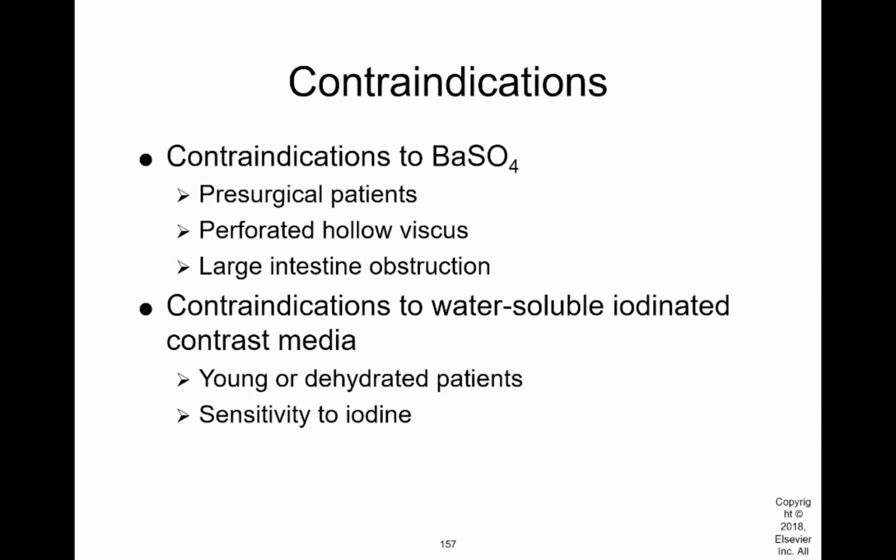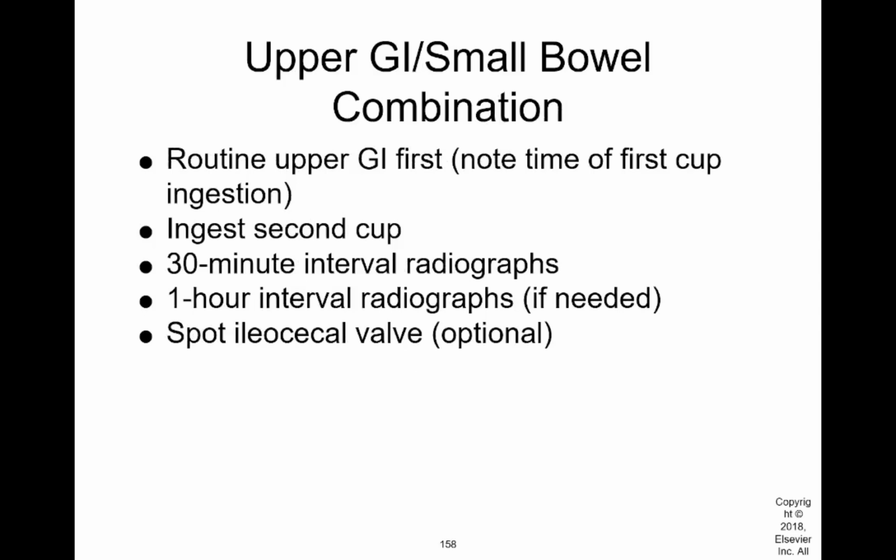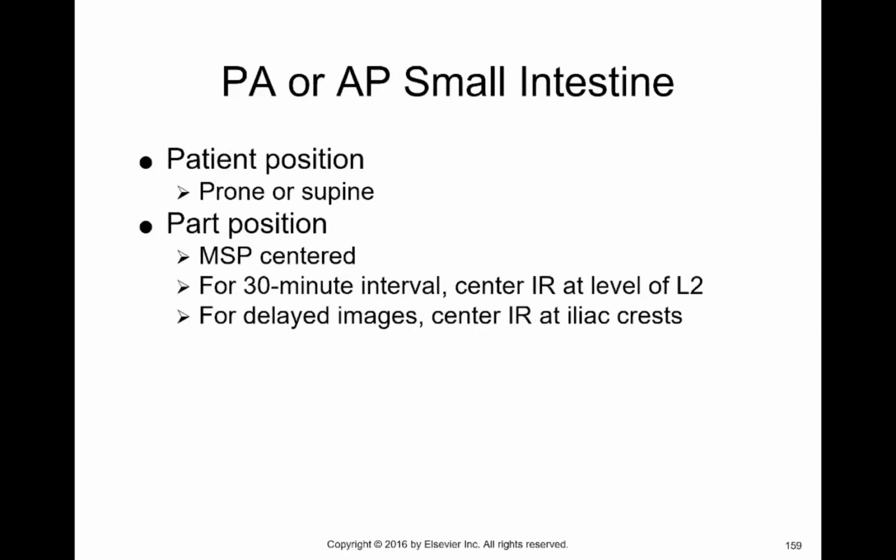But some considerations for the patient: if they are dehydrated, the water soluble contrast acts as a laxative and it can further dehydrate the patient. Young patients or older patients are more prone to dehydration. And again, I already talked about the sensitivity to iodine. So just more of the same stuff, really.